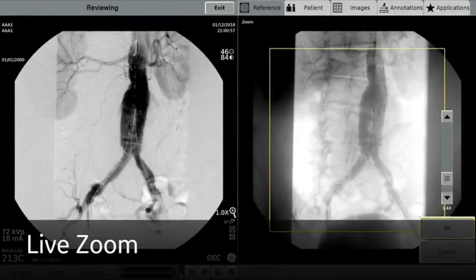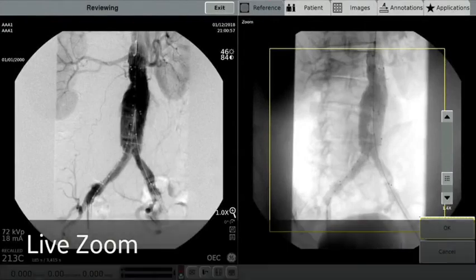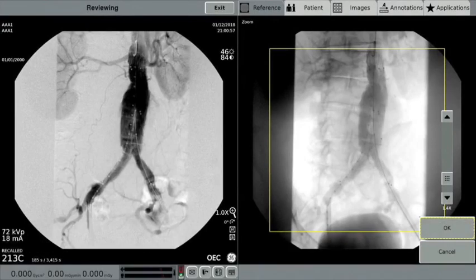Live Zoom is a feature available on the OEC Elite CFD. It delivers up to four-time zoom of the image to either review or take additional fluoro or cine images in the zoom setting without requiring additional technique or dose.